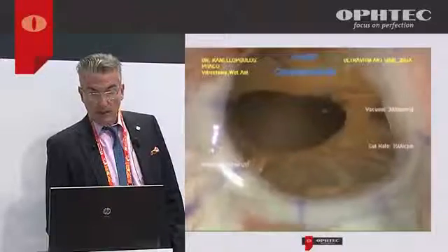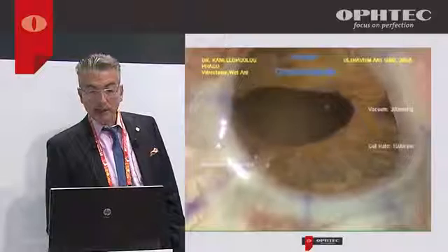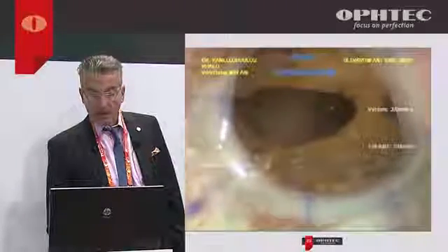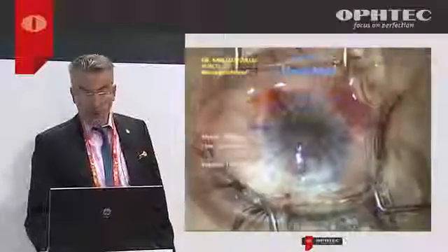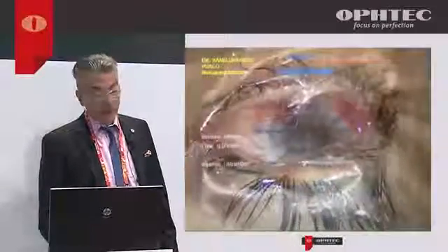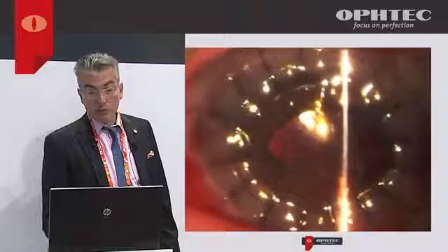And you can see on this snip, I was able to get a good grab of iris, snip it in the haptics, and I have good lens stability, and then finish off with penetrating graft, as you can see here, in a normal fashion. And this patient ended up doing pretty well. This is an aphakia patient. Not many of those around anymore, so this is much more easy.